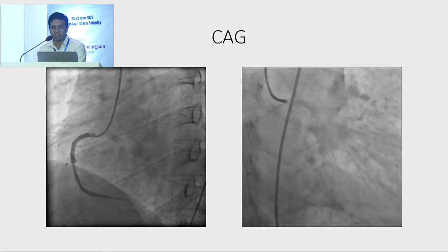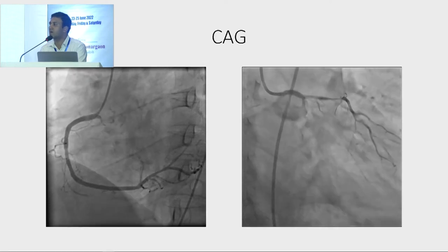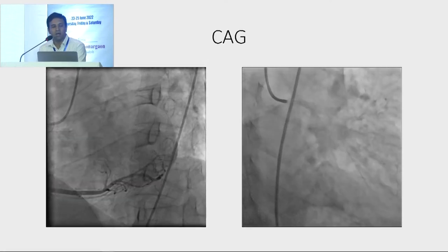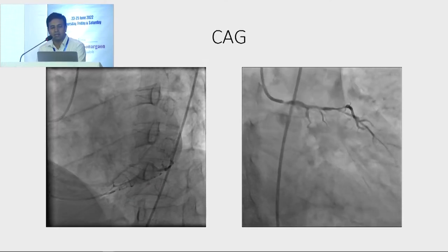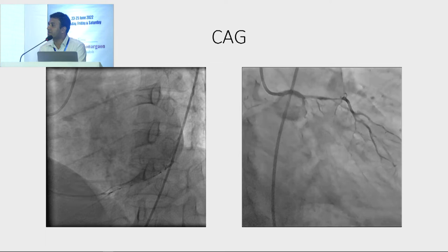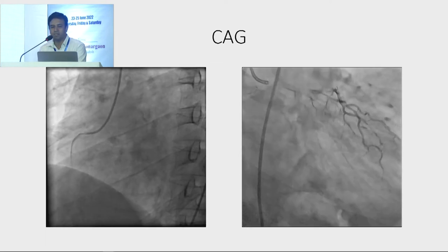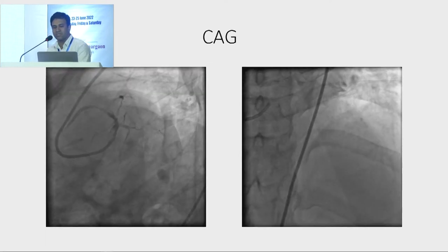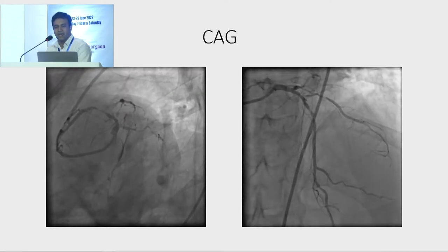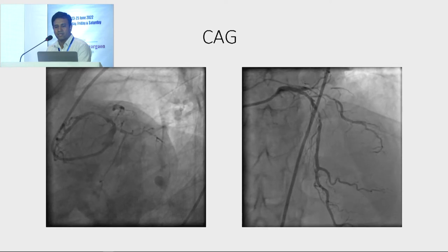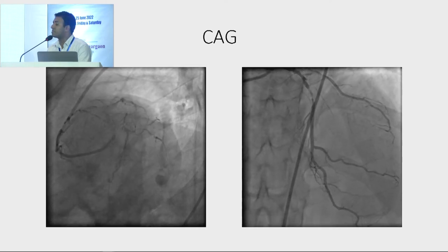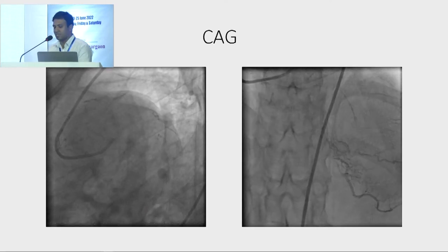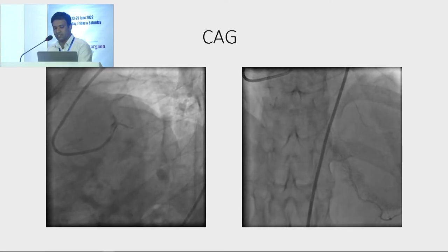This is his left system. We can see his circumflex is rudimentary and the right coronary is dominant. You can see his LAD is diffusely diseased from proximal to mid-LAD, with maximal stenosis of around 90% at the mid-LAD.